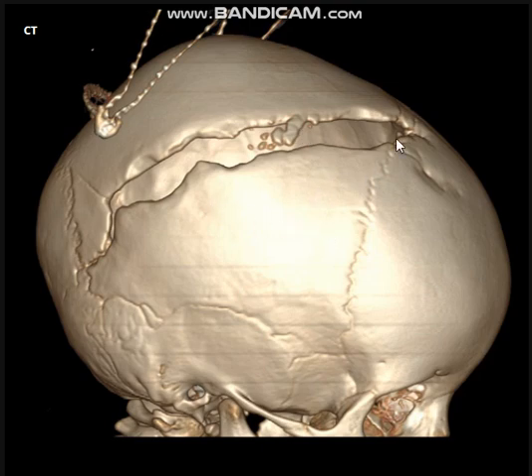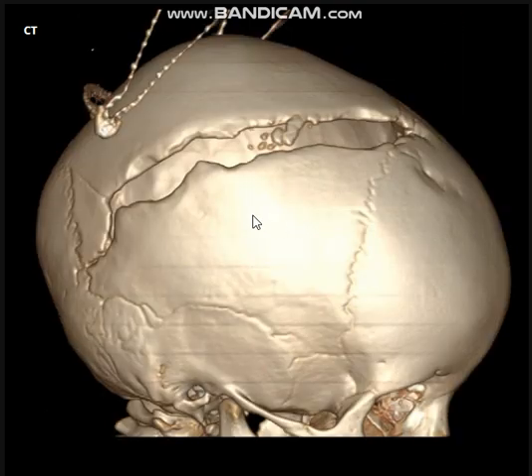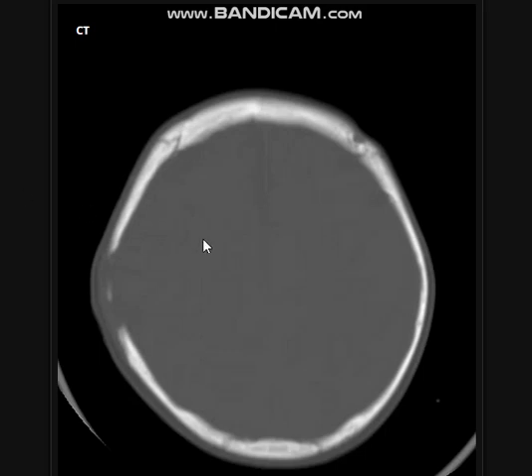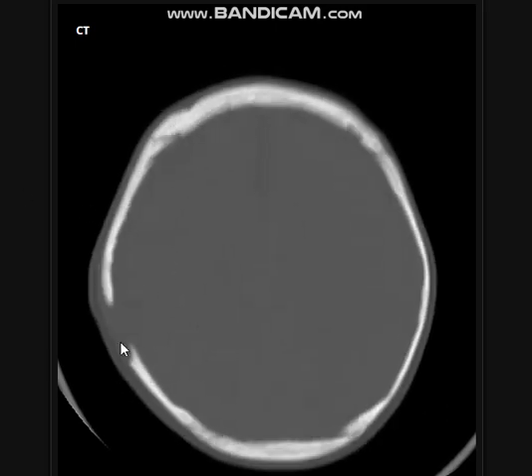So in this case it's not just a fracture, but we have a long and gapped fracture. When we examine this on the axial bone window, you can identify that we have a gap between the fracture ends of this bone.